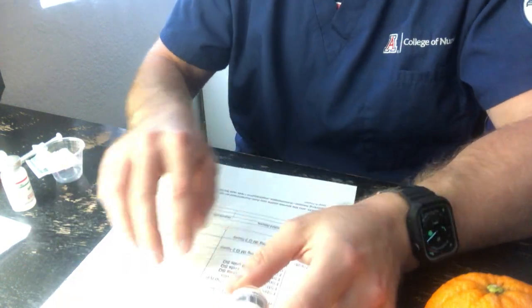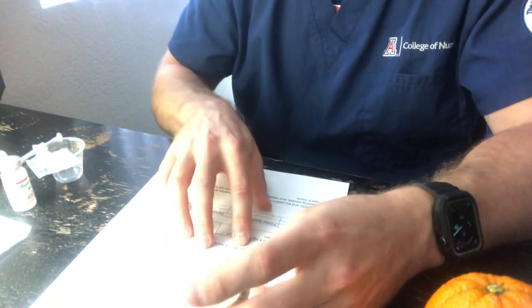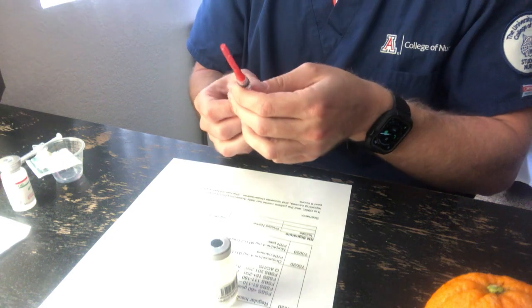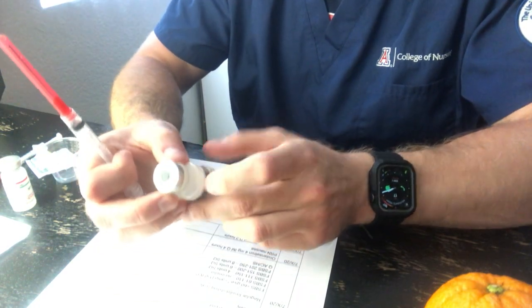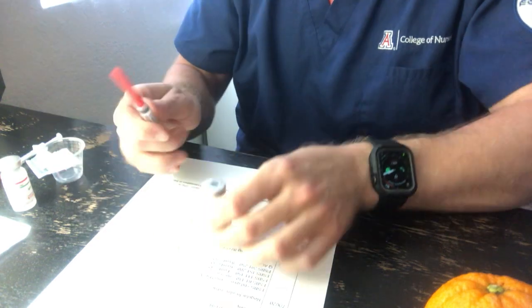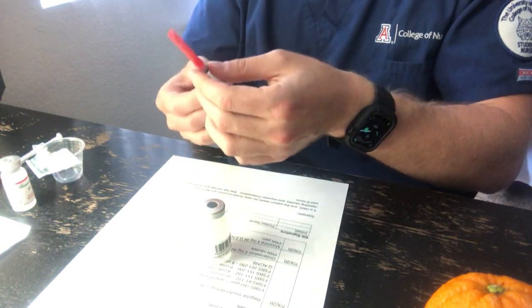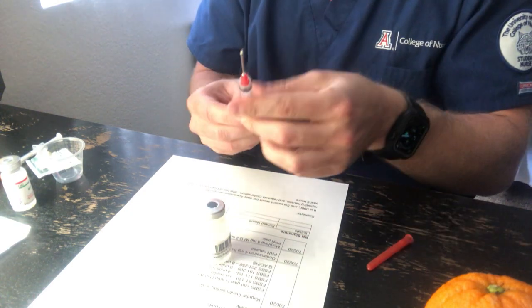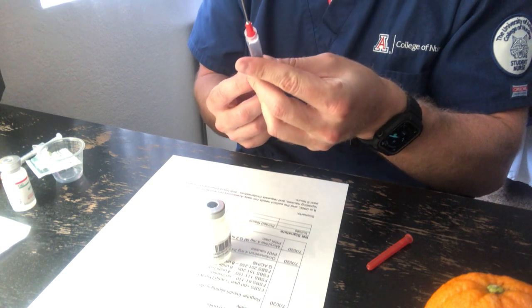I have ondansetron, orders for ondansetron, right medication, dose 4 milligrams. So I need to pull a total of 2 mLs because this is 2 milligrams per ml, and I need 4 milligrams, so I need 2 mLs. So I have a blunt fill needle on a 3 ml syringe. So I need 2 mLs total.